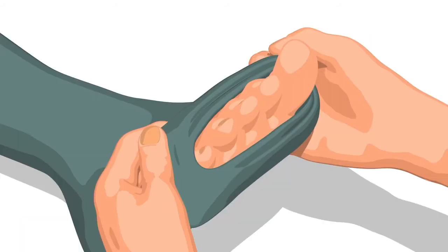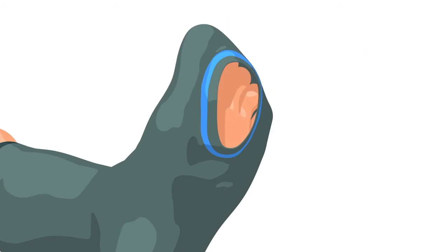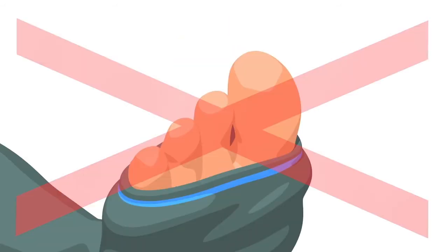The stockings have an inspection hole to allow observation of the toes and access for circulatory checks, including capillary refill and foot pulses. Once fitted correctly, this opening should always be positioned underneath the toes. The band is designed to prevent the stockings slipping back over the toes, which should never be poking out.